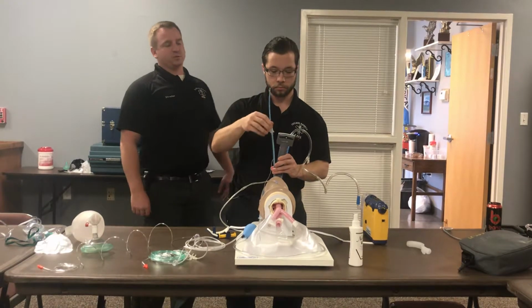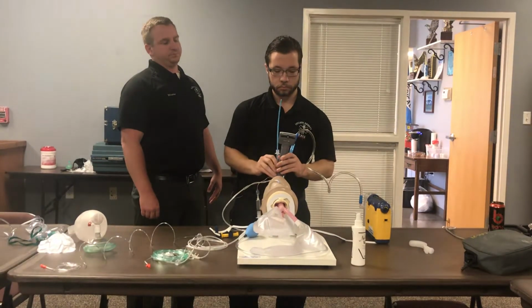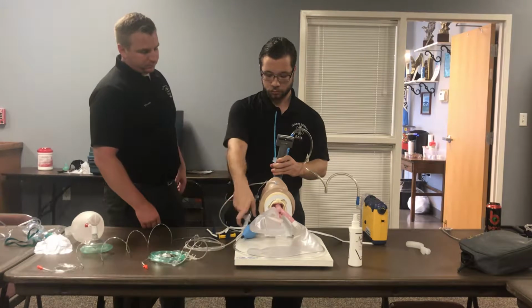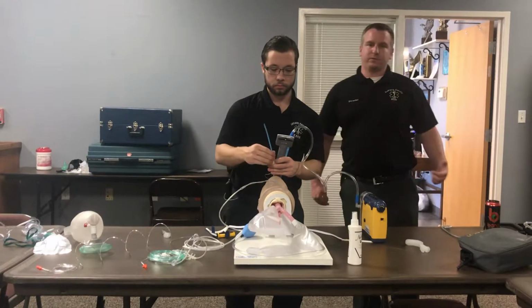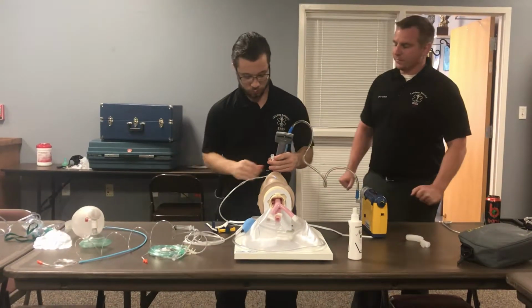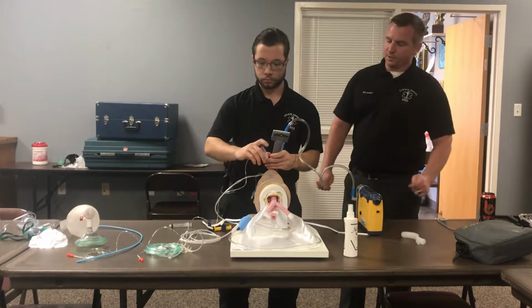He's inserted the bougie through the cords. Now he's going to follow that up with the tube. He's going to insert the tube just a little bit further. Notice that he's left the suction device in there, because Levi knows that if this patient starts vomiting again while he's intubating, or blood starts pulling up while he's intubating, he can continue to suction the airway and not get it full of vomit or blood.